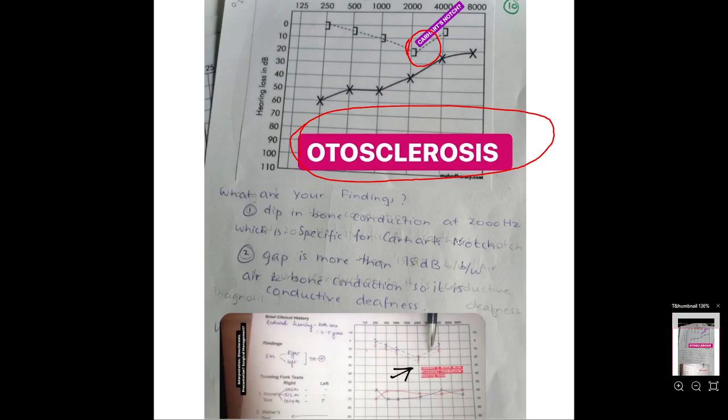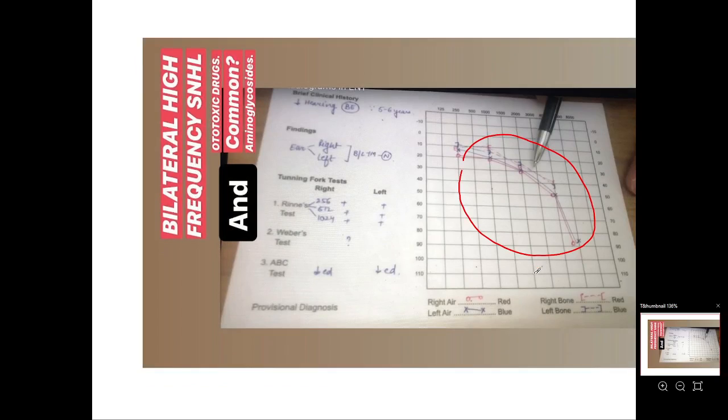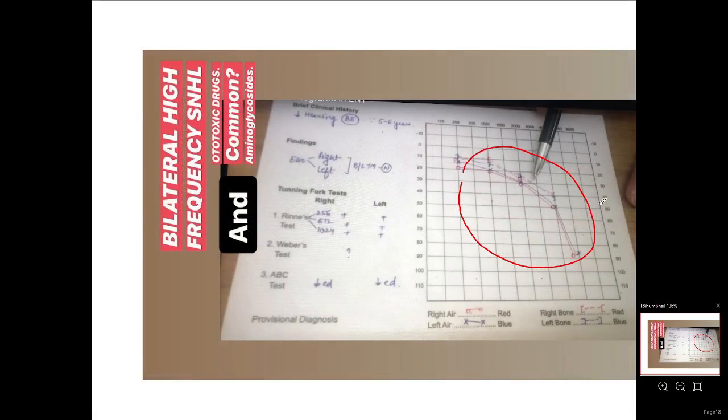Okay, this is again conductive hearing loss. This is sensory neural. It is due to the aminoglycoside, the ototoxicity. Okay.